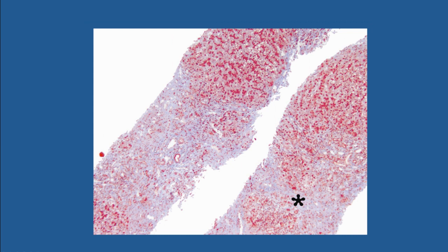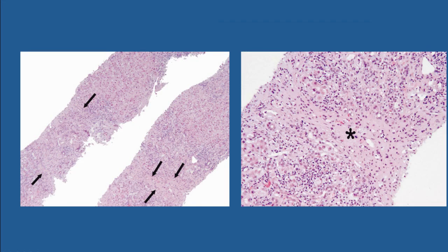And you see how this looks pretty blue. Now, it's not as dark blue as the collagen that one sees in portal tracts, but at a low power, you might mistake this for fibrosis. But actually, when we look at it on a high power, we see that this is really just collapsed parenchyma. It's not fibrosis, it's just collapsed parenchyma. And so one has to be mindful in cases of severe hepatitis with areas of collapse not to overdiagnose fibrosis.